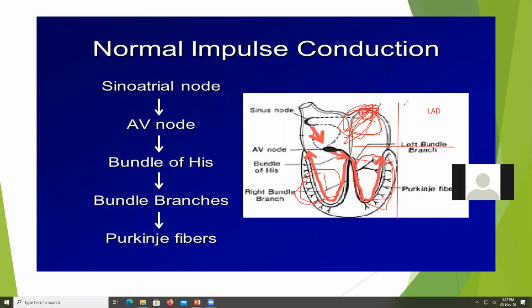So that explains why our left ventricle is the most muscular part of our heart muscles, because most of the electrical impulse or energy is given to this septum, or this area of our heart muscle here. When the impulse is going this way, which I don't know if it's possible, that is considered extreme axis deviation.